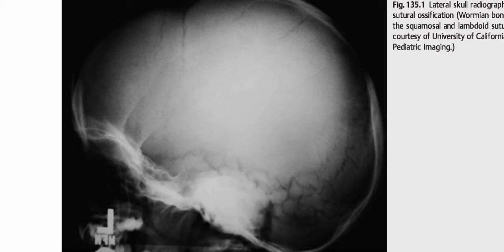This is a child who presented with facial abnormalities. On the lateral skull radiograph, there is intrasutural ossification — wormian bones — involving the squamous and lambdoid sutures. The key finding is wormian bones and the diagnosis is cleidocranial dysostosis.